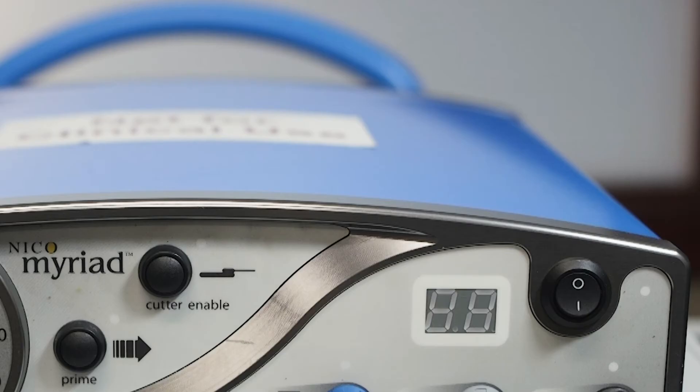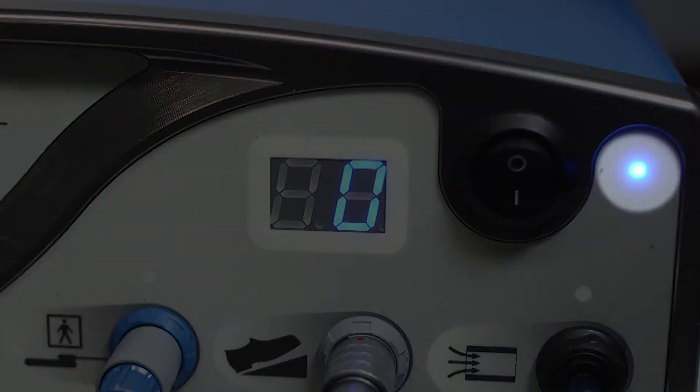After making all necessary connections, turn the system power on. The indicator light next to the power switch will illuminate.